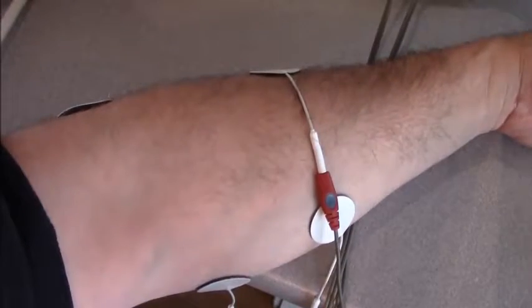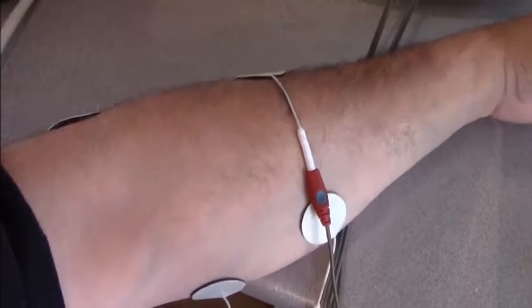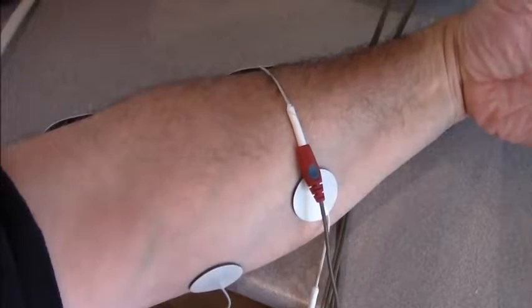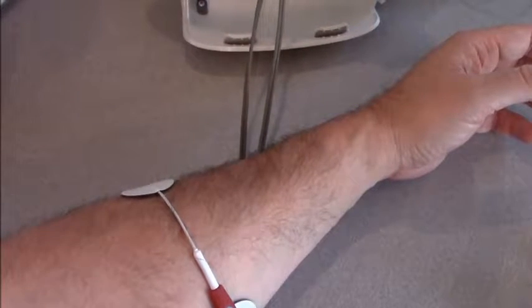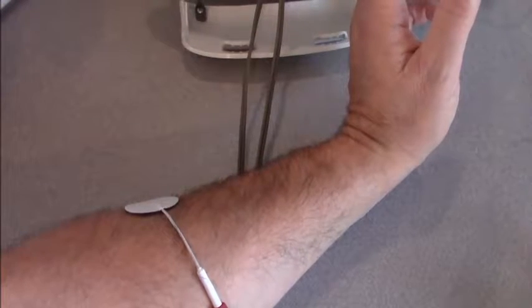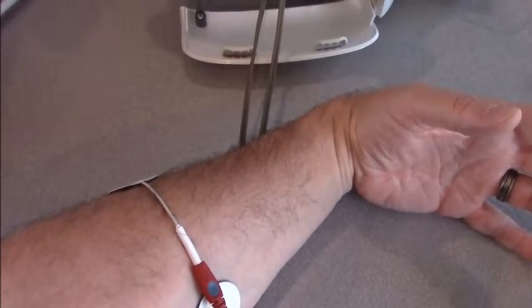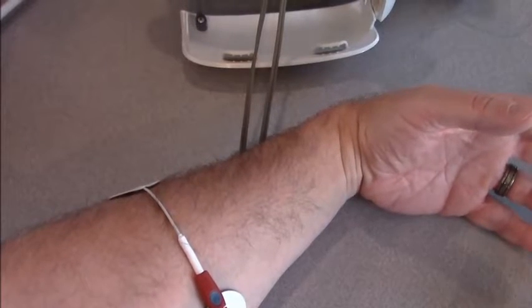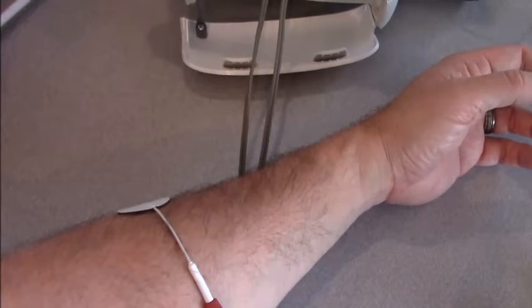I've changed the cycle time for this example: four seconds on, with channel one as the extensors and channel two as the wrist flexors, and a 12-second rest phase. It transitions from extensors after four seconds to flexors for four seconds, then 12 seconds of rest before initiating channel one again. You actually get 12 plus the four seconds of extra rest, but you can certainly make adjustments if necessary.